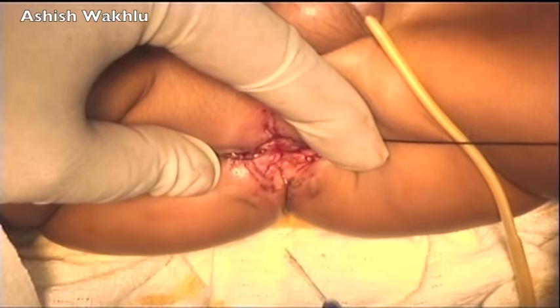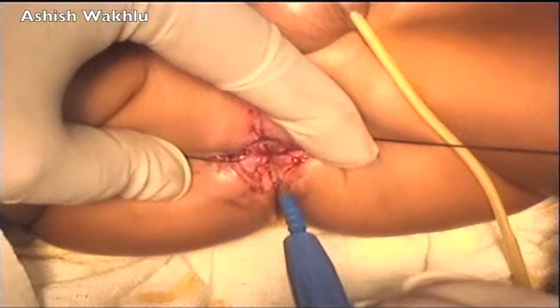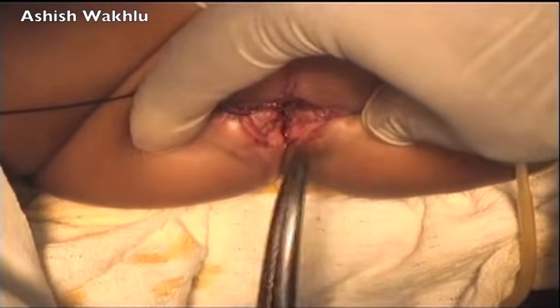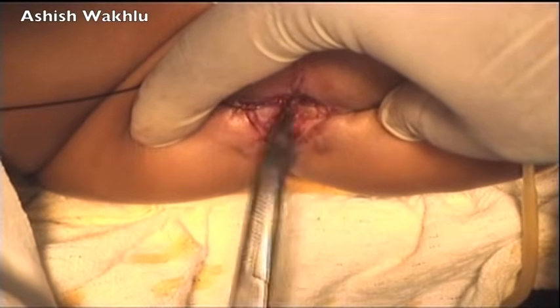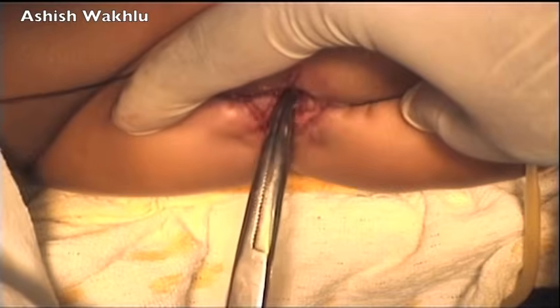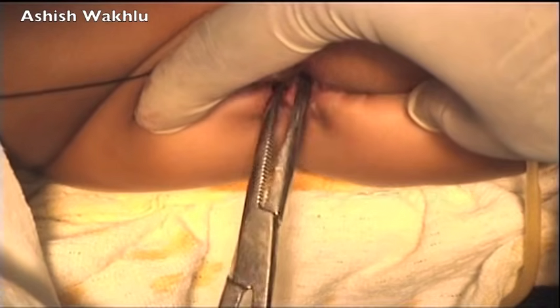Now, using the time-honored technique of dissection through the center of the external anal sphincter, which you can see contracting a little in response to the diathermy, and following this we use the standard technique of spreading through the external anal sphincter using a blunt pointed hemostat with the tip turned downwards. It was not totally easy because the first surgeon had dug a little deeper than anticipated.